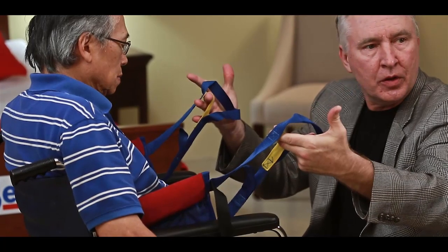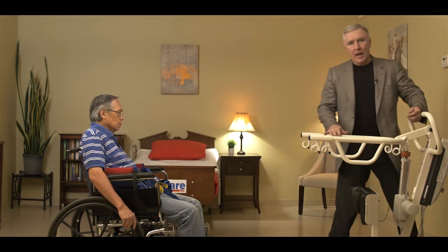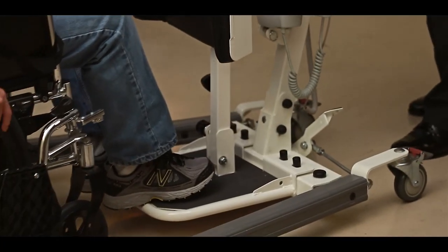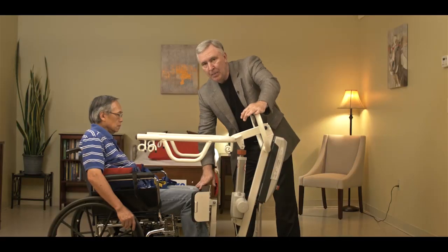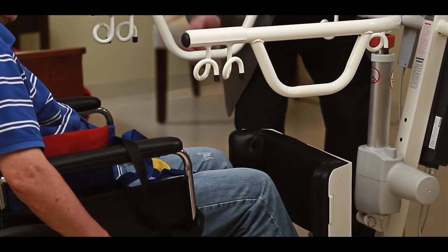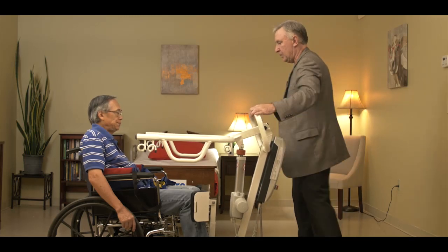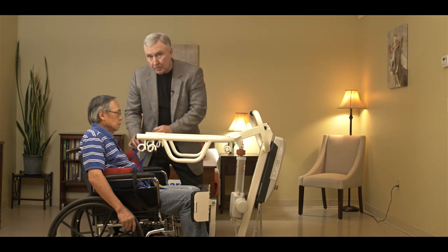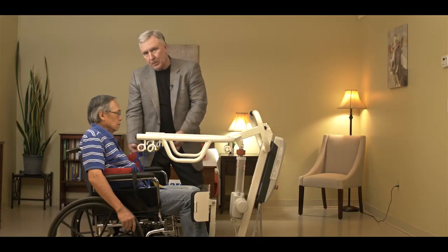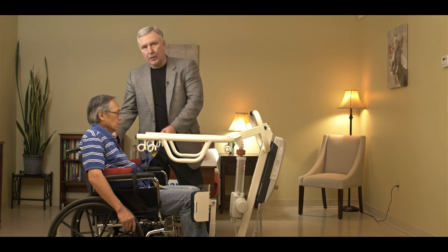Now we want to make sure we have access to the sets of loops on the support vest. The next step: bring our sit-to-stand SA product up to the patient, open up the base, put the feet on the platform, and bring the knee brace as close as you can to the patient's knees. Adjust the knee brace in and out, up and down so it's in the right spot. Lock the wheels and connect the loops on the vest to the first set of hooks on the SA. There are three sets of loops — the shorter the loop, the taller it stands somebody; the longer the loop, the further away the patient is from the lift during the transfer.